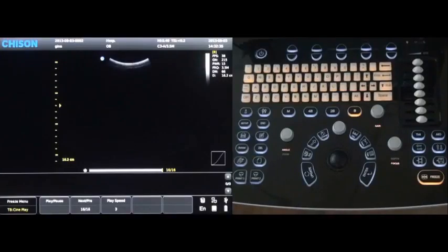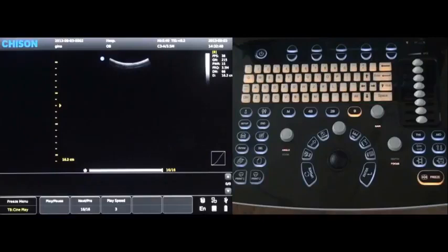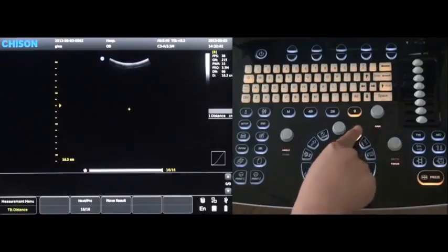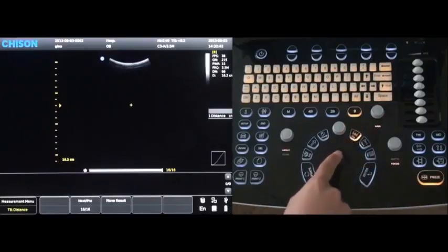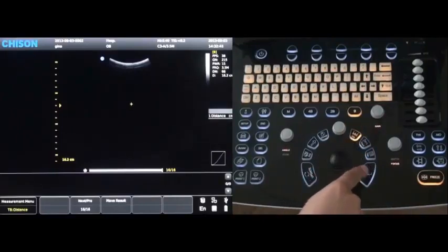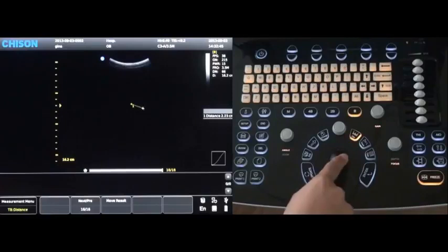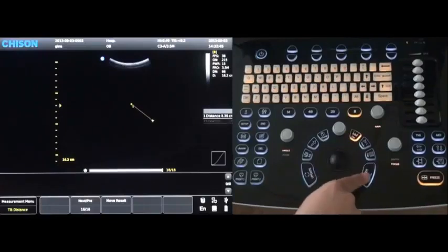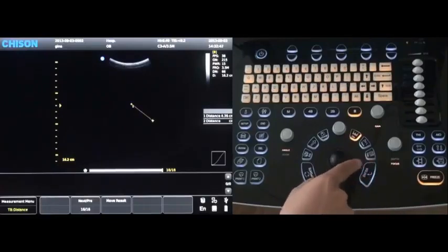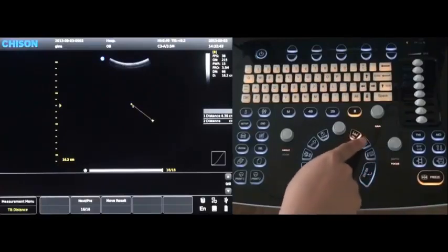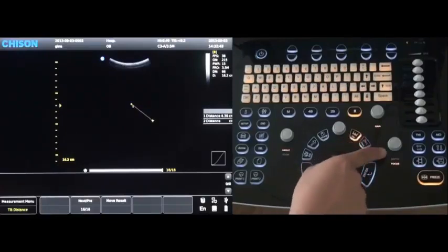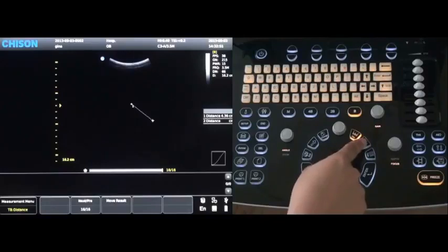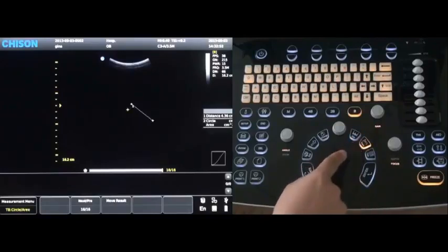Press the distance key, you can do the distance measurement. Press the trace key.